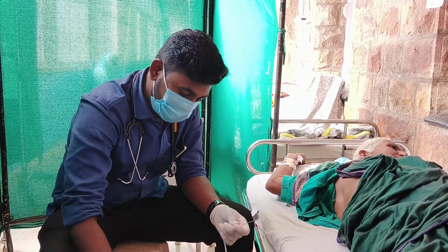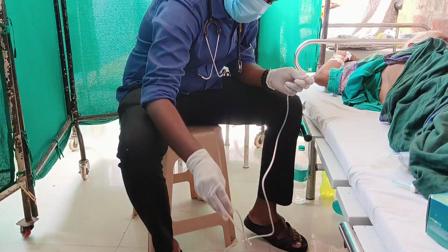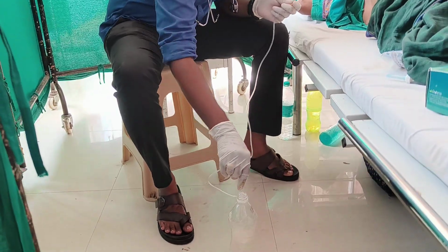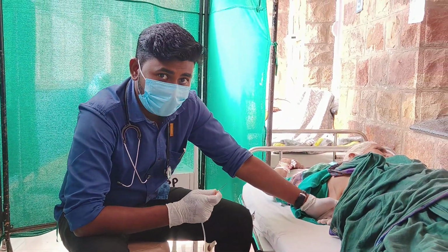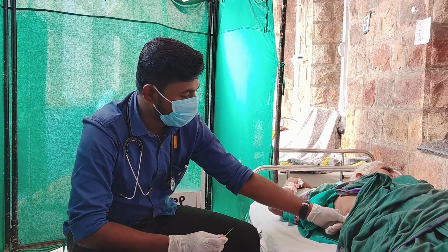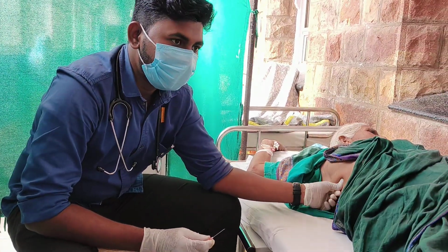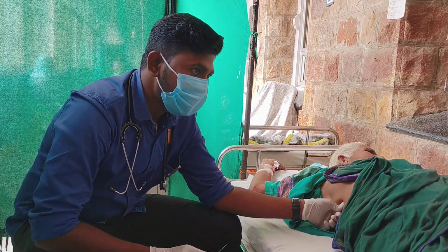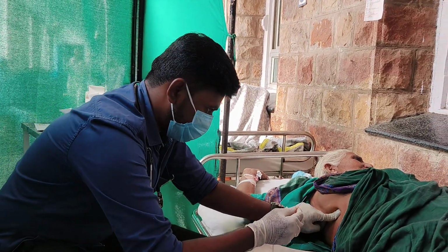We have to take this bottle with this IV set and insert it in this bottle. If air is there between the pleural spaces, there will be bubbles here. So you have to push here and select the space. I will select around the 4th to 5th intercostal space, and I will push now. We have to try whether it is coming or not.